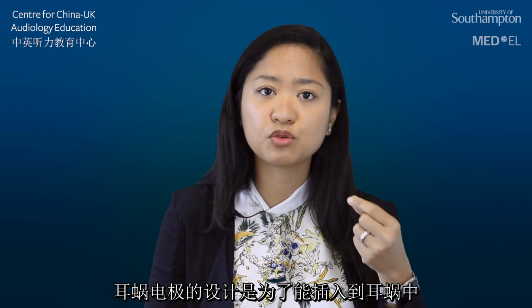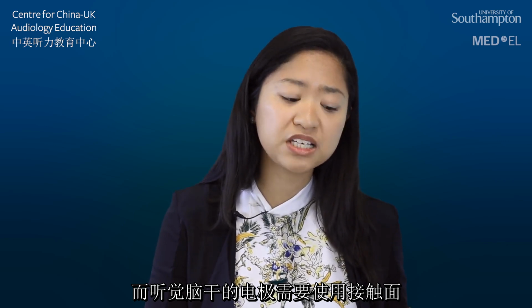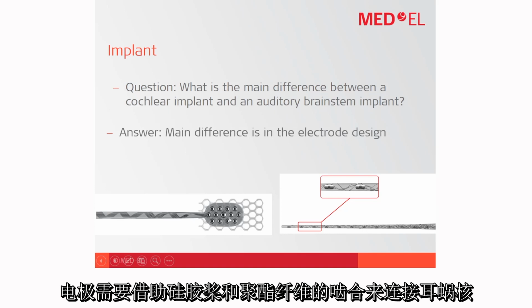So the electrode design of a cochlear implant is really made for insertion into the cochlea, while an ABI electrode array, where the cochlear nucleus tonotopic map is more parallel and oblique, is a surface electrode design where you have the electrodes on a silicone paddle and you have a polyester mesh. This is the ideal design for placement on a cochlear nucleus.